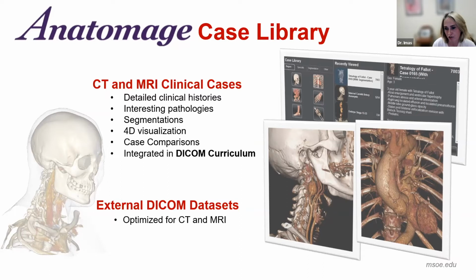And finally, again, I find that feature very, very useful in my classes. Anatomage allows you to import, open and display your own image data set. We have access to DICOM image data sets that come from various hospitals, and we have a library of these cases ourselves. I like to use those in my classes, so we can visualize our own cases.